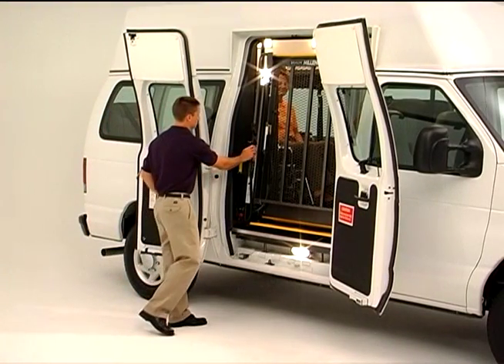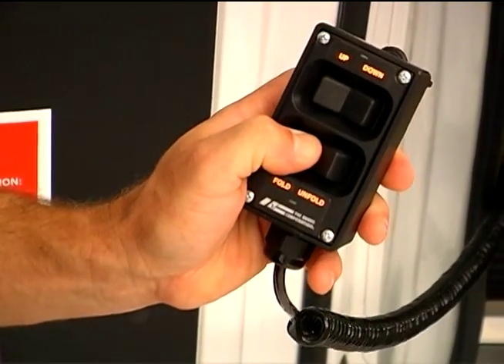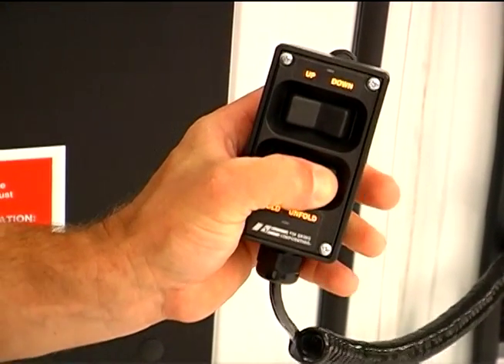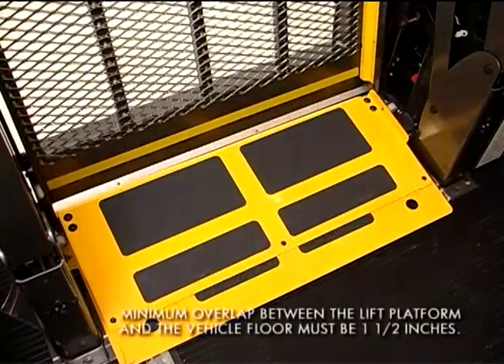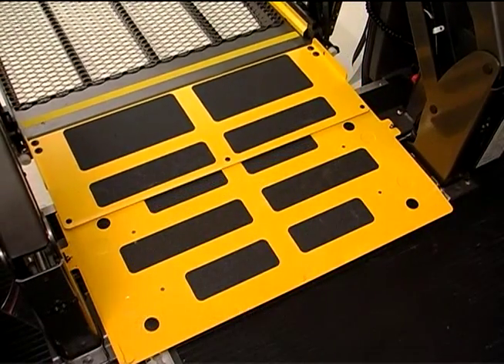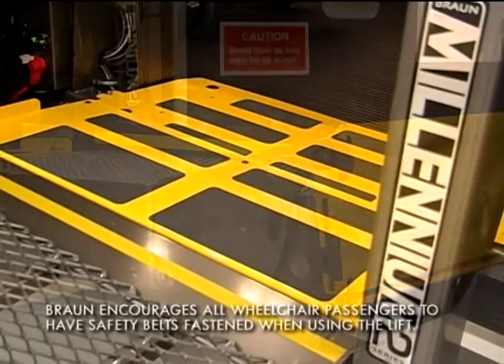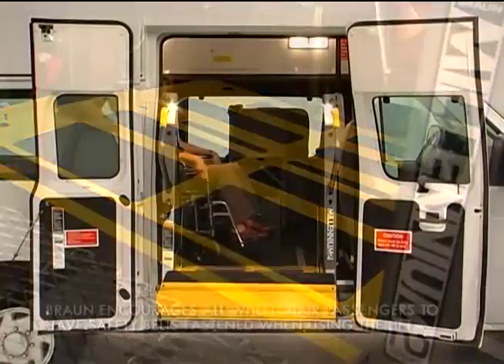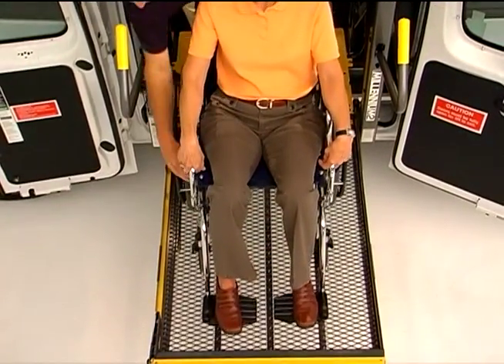In the event the platform does not unfold from the stowed position, simply press the Fold switch to fully fold the platform, which will in turn release the lift-tight latches. Then press the Unfold switch and the lift should unfold with no further hesitation. Once the platform is fully deployed, be sure the inner barrier rests solidly on the vehicle floor and check to be sure that the outer barrier is fully raised and locked. Also, be sure that your passenger's safety restraints are securely fastened. Then guide your passenger onto the platform, being sure to keep the wheelchair between the yellow boundaries.